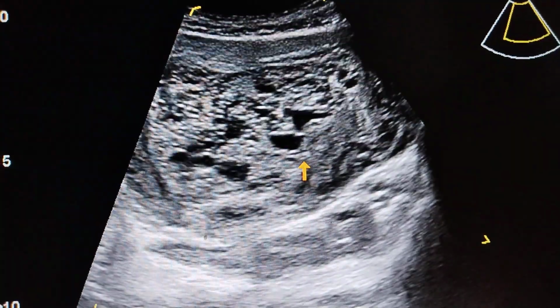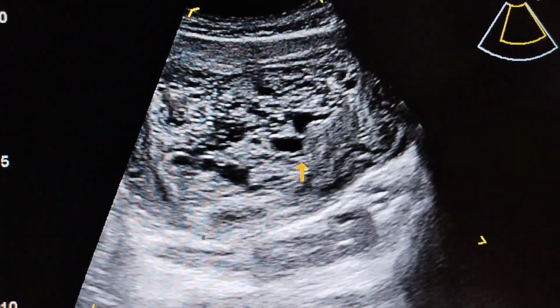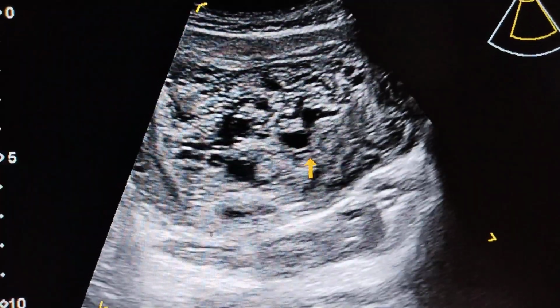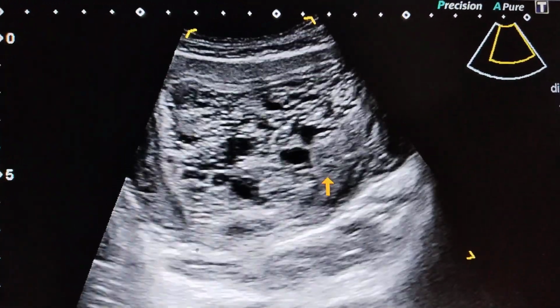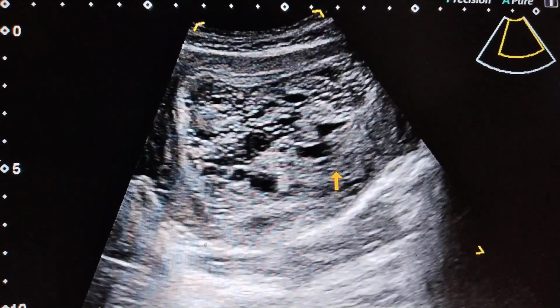When an invasive mole is also present, the velocity is very high and there is turbulent flow. Here the velocity is not too high and the turbulent flow is not present. So the patient still does not have such a complication.